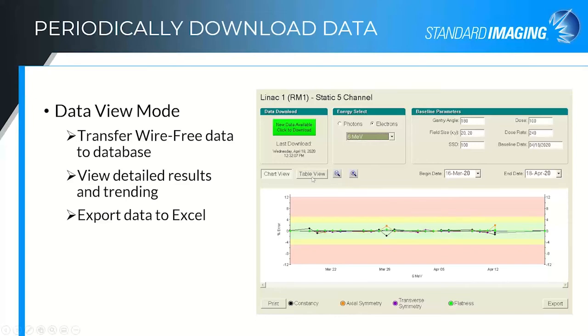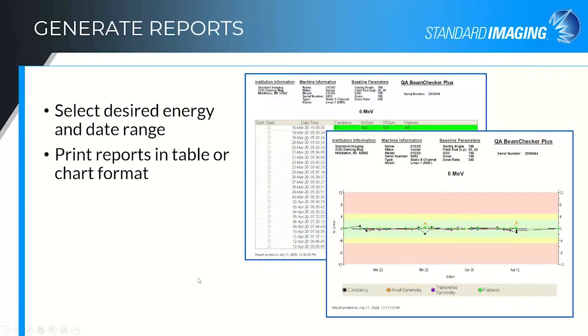You can also look at this data in a table view where it just tabulates all of those values for you. And you can print the data, and we'll look at that one next. And you can also export the data for your further use. So here's an example of what that information would look like. Again, must have a slow internet connection today. I'll wait for that one to come through. There we go. So again, a simple report that you can sign off on and store as a PDF, or exporting the data in the tabular form or as an Excel .csv file that you can use.